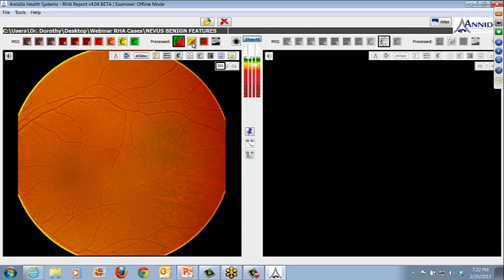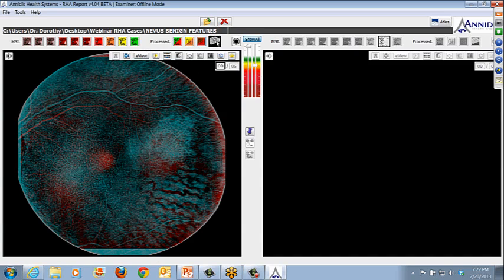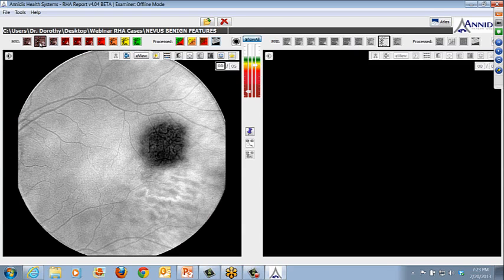That's actually quite nice in following these lesions. And of course, the stereo map. Okay, that will give you some sense of not so subtle elevation, a little bit more significant elevation. Okay. Definitely going to see a large elevated lesion with the stereo map. You know, if you've got 1 millimeter or less, you may start to appreciate some elevation, but not in the very subtle cases. Okay.